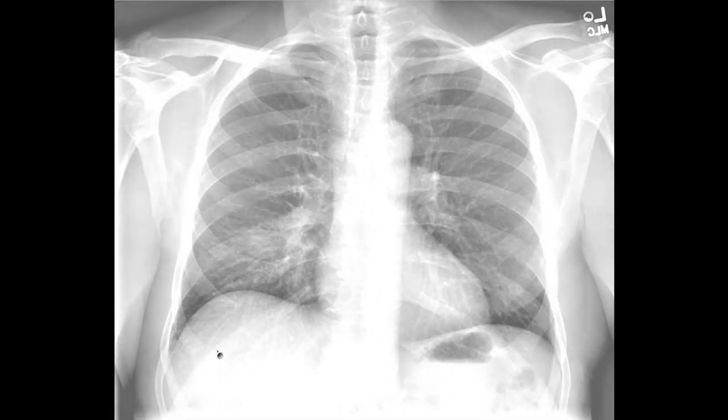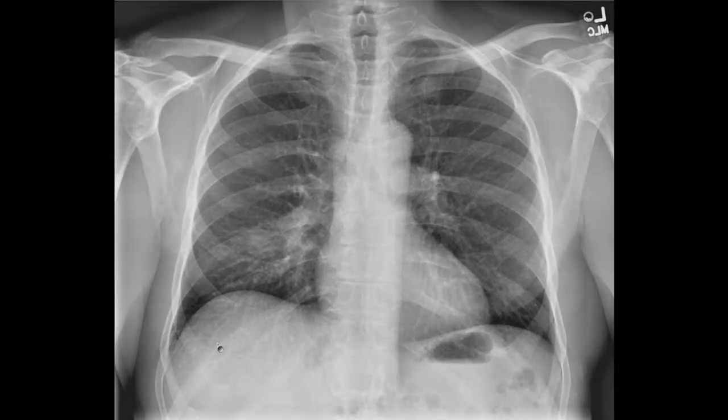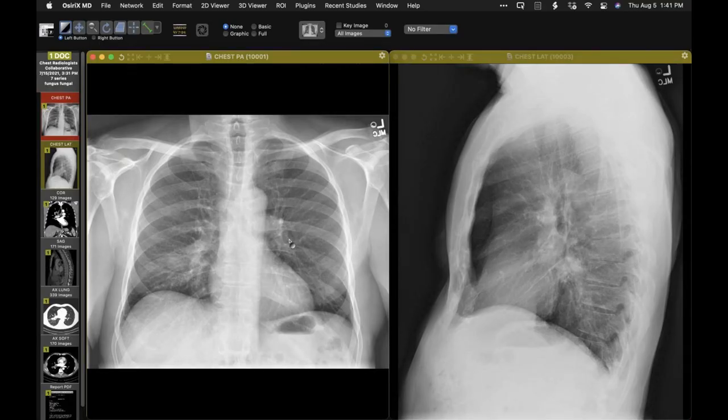Let me bring this up because I noticed when I read the radiograph that away from the opacity, I saw septal lines. Now, they're kind of subtle on the radiograph, but you'll see in a moment that these turn out to be real, that they are septal lines. So when I saw that, I was really worried about a lung cancer. A lung cancer with lymphangitic tumor spread, a lung cancer with potentially lymph node disease associated with it, but he's a relatively young person and not a smoker. So I certainly recommended further evaluation with the CT.